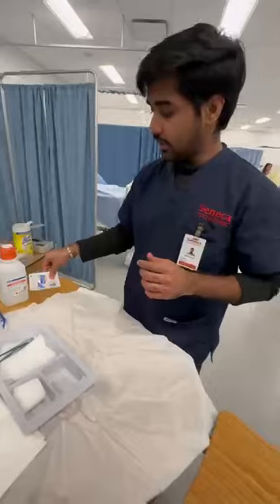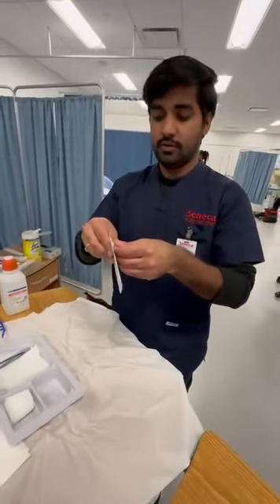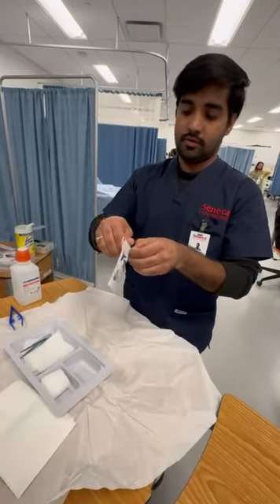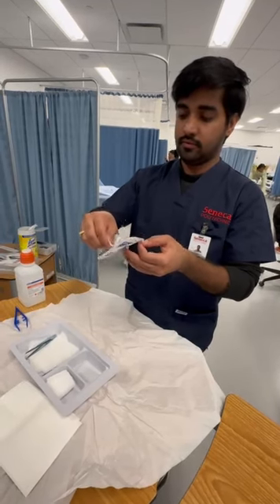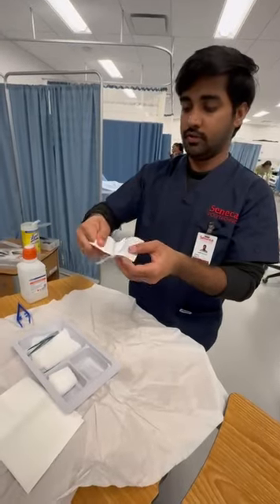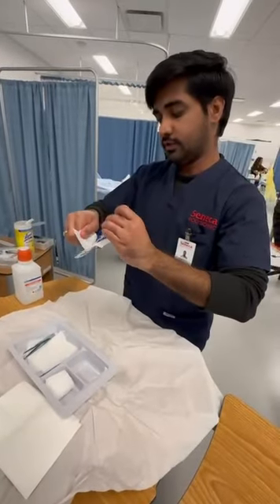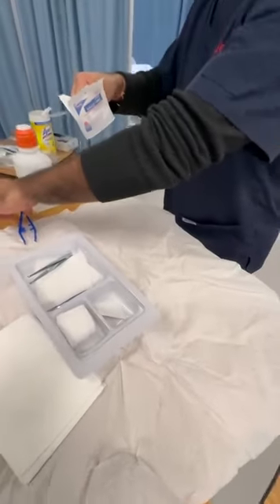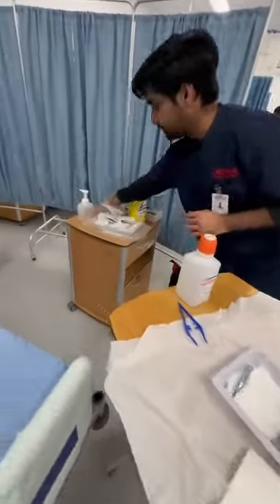Okay. Now we have to open the gauze. Okay. So let's open it. I use it between the right and the left, so that you can keep his mouth open from closing. Now I'm going to do the top. Make sure we are not touching it, and using the sterile steps to use the gauze in it here. Okay, putting it back in here. This is like garbage. Check the client.